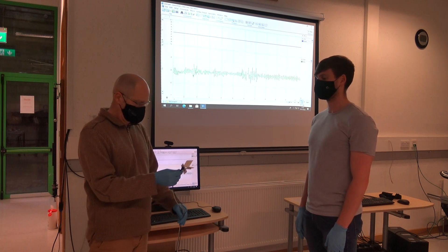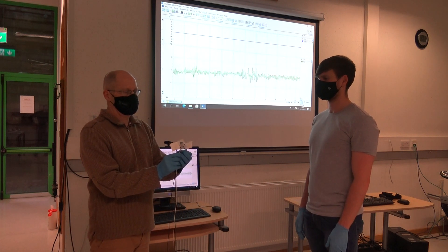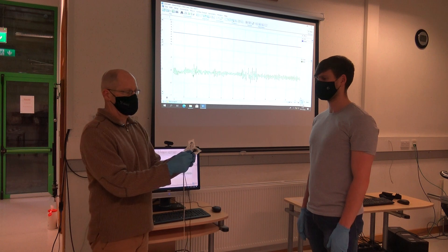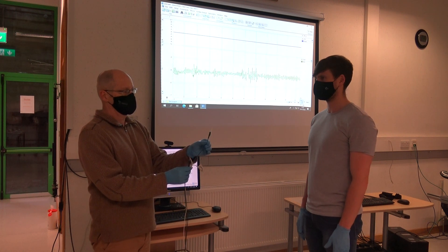The format we'll be using in this lab is a three lead ECG, so you will have three leads. You will have a black positive lead and electrode, you will have a white negative lead and electrode, and a green earth and electrode.